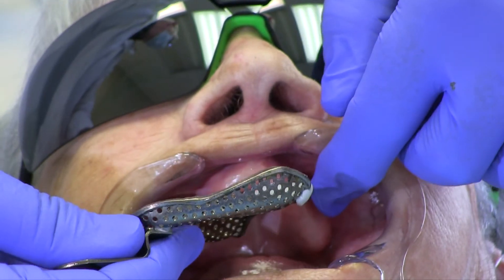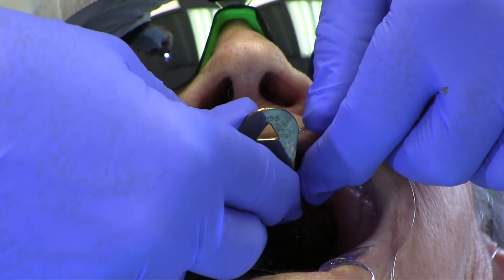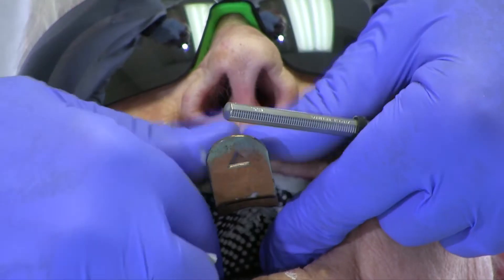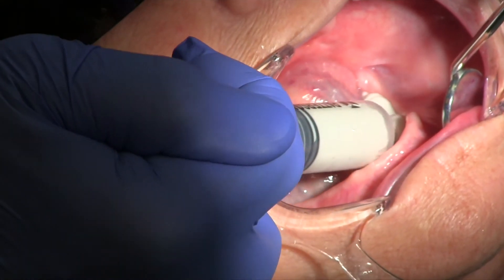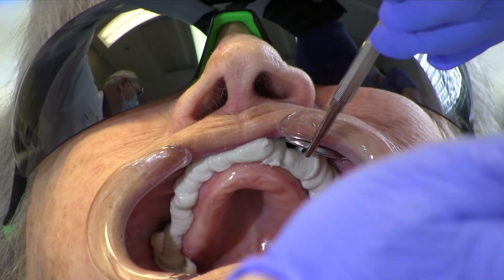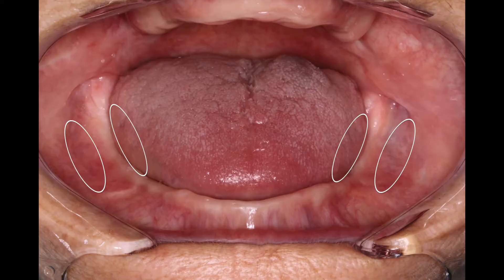Place the tray with wax intraorally and momentarily apply pressure to adapt to the palate. Areas of the tray that are severely short of the vestibular roll can be extended with wax or compound as well, but normally if you're using a syringe technique this is not necessary. Complete denture impressions can be made with a properly loaded edentulous tray alone or combined with a syringe technique that helps to capture the full extension of the vestibules. A syringe can be used for the whole vestibule or for just areas that are difficult to capture.